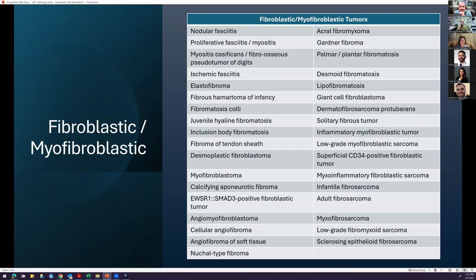The reason why fibroblastic tumors are so difficult is because there's so many of these same things, there's a lot of overlap. There's a lot of different tumors that fall into the same spectrum as we've talked about. Go back through, obviously, and listen to various areas, but I want you guys to make a concerted effort to really look at these tumors when you get them and try to justify for yourself why you're making this diagnosis. And then also try to put it at least into a category.